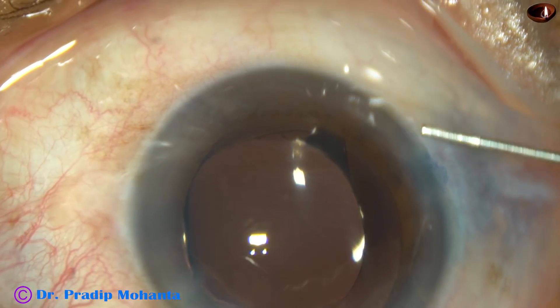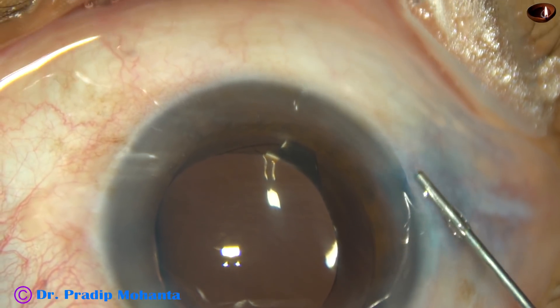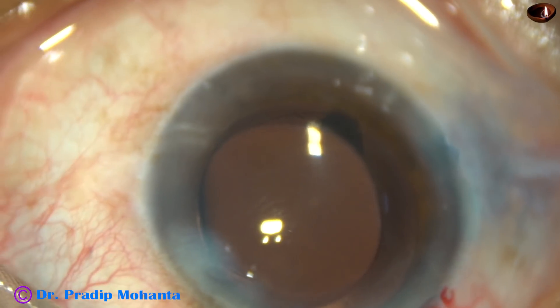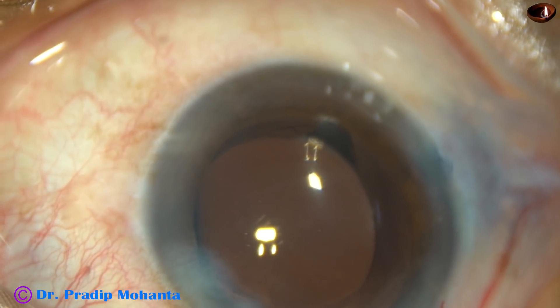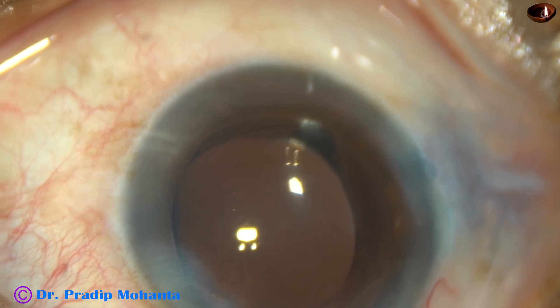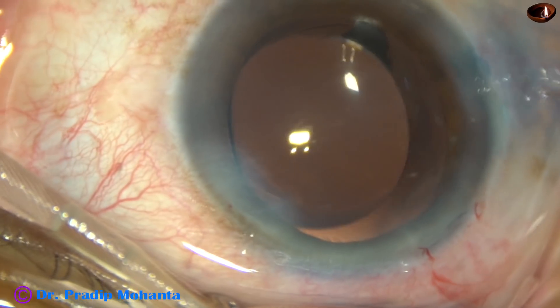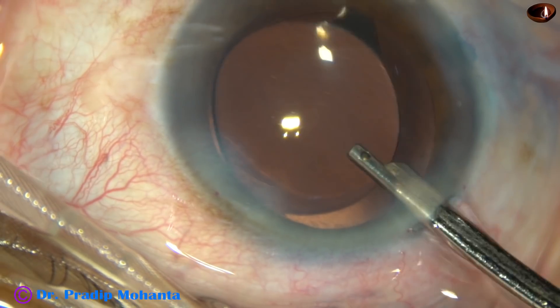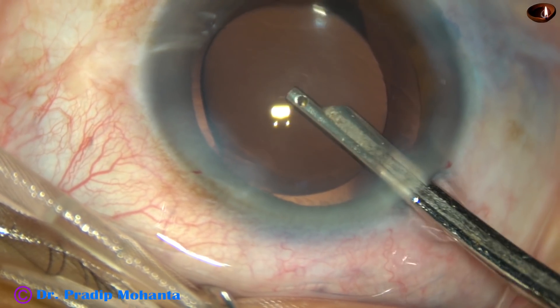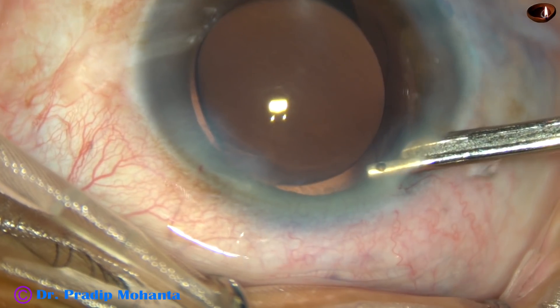Now, the side ports are closed by corneal stromal hydration on either side of these stab wounds. This is a very essential step. The main wound that I create usually doesn't need hydration. And now, this is the final lavage of the anterior chamber. Whatever visco sticks to the corneal endothelium comes out at this stage. And then the anterior chamber is nicely formed and the case is concluded.